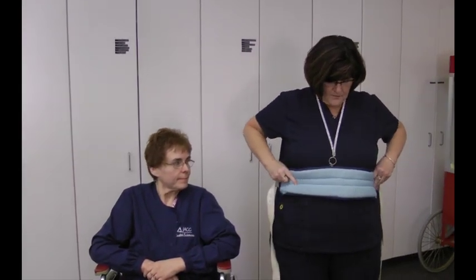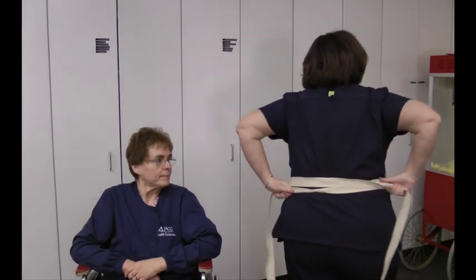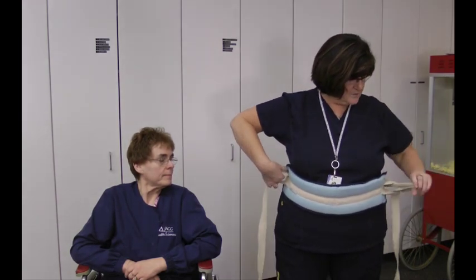There we go. Wrist restraints. The next one I'd like to demonstrate is a waist restraint. This will go on in the front, and this is the way it's usually put on. We cross the straps in the back, and then we bring them through the loops right here.